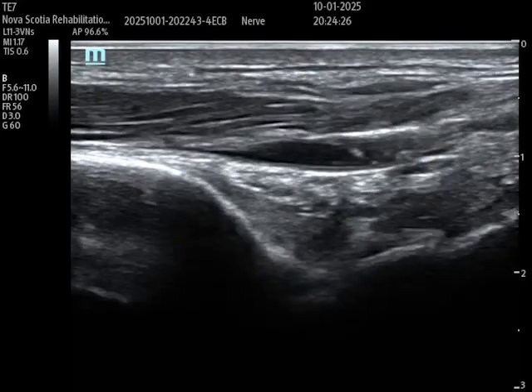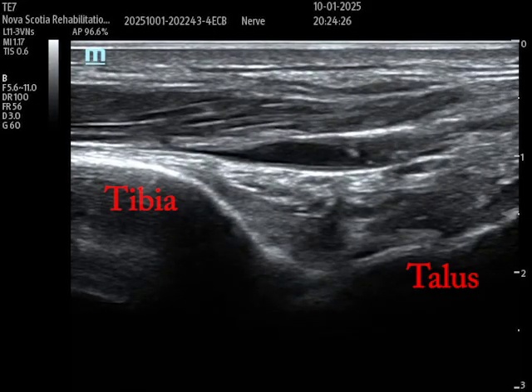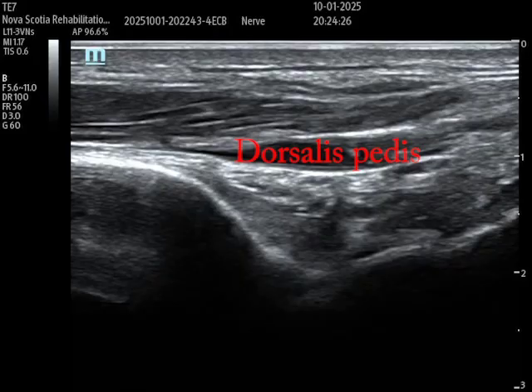Here I have the ultrasound probe in long axis. On the left of the screen we can appreciate the tibia, and on the right, more distal, is the talus. Between the two is our tibiotalar or ankle joint — a spot where you could inject. Above the joint is an anechoic region where the dorsalis pedis artery is; if I put Doppler on, it'd be pulsatile. That's a risk with this long axis anterior approach — you need to avoid that artery.